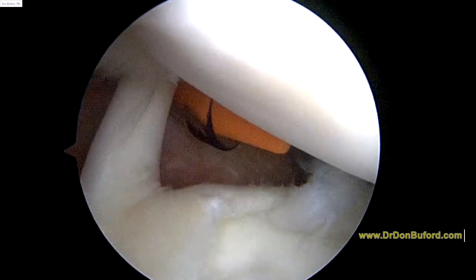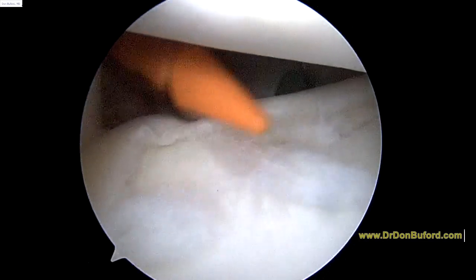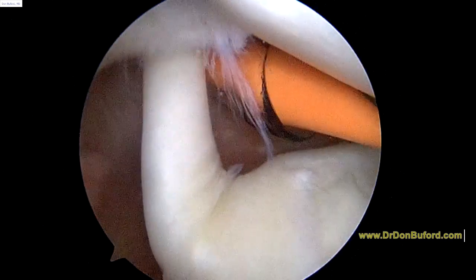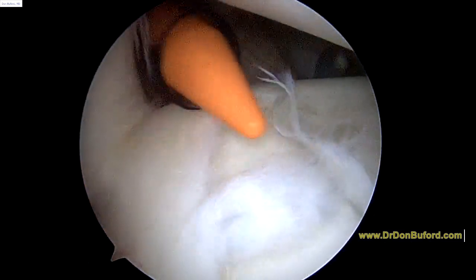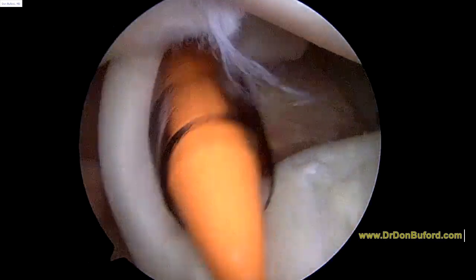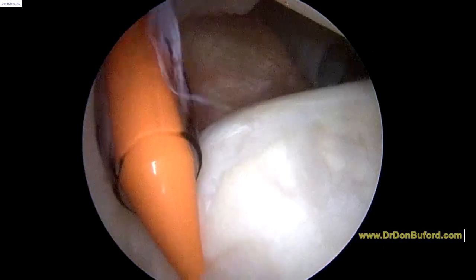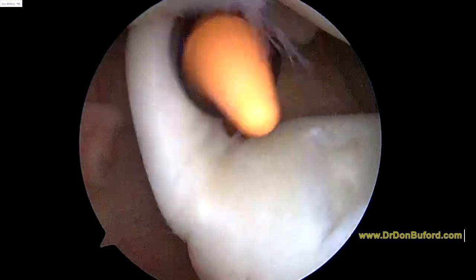So as we start to look around, we can see right off the bat we've got some tearing here in the superior labrum. This goes along with the diagnosis of a SLAP lesion, which you have. See, this is torn here. All this tore from this part of the shoulder with the recurrent instability. And so this is what we call a SLAP lesion. We can see how it's displaceable, meaning I can move it. And this anchor just isn't anywhere near as stable as it used to be before it tore.